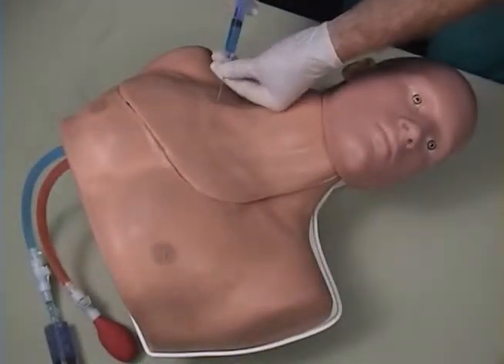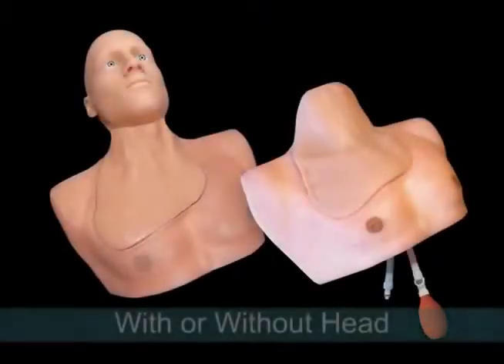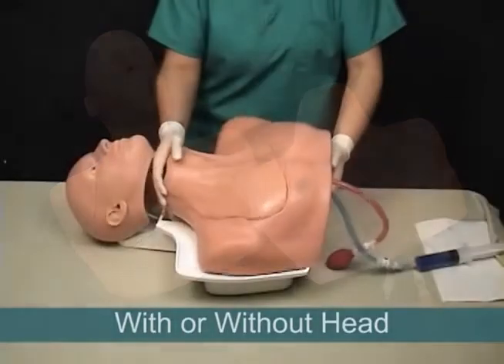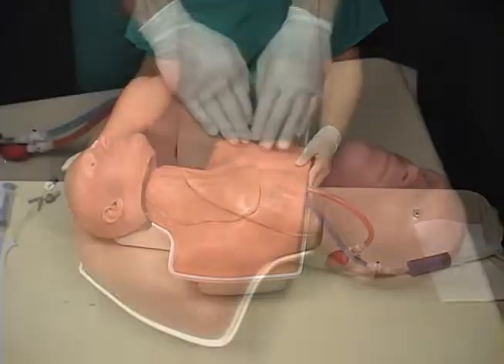Central LineMan is the industry's most affordable solution, both to purchase and to operate. The system can be purchased with or without the articulating head, and Simulab offers training packages for additional flexibility and savings.